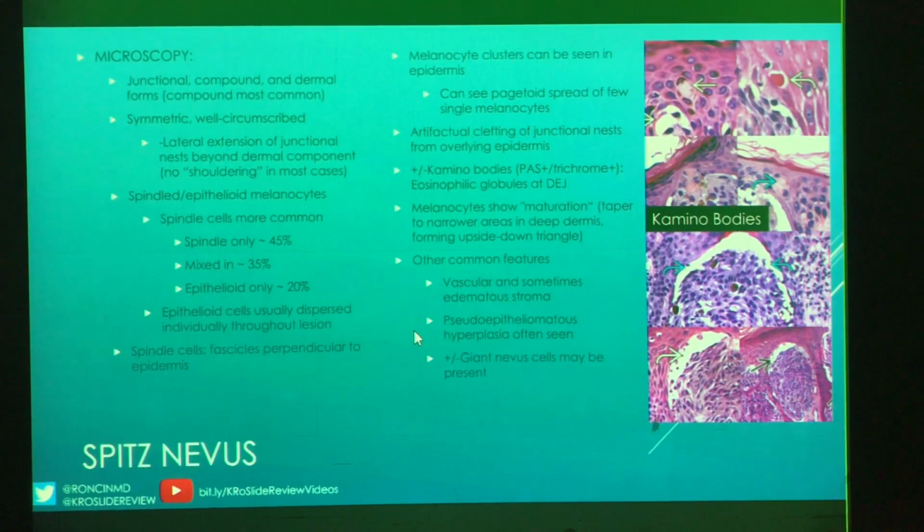So again, going through other things, the clefting is what we were looking for in the case where we were talking about the spaces that don't normally exist within the dermis. So that's an artifact that is often seen in a Spitz nevus.